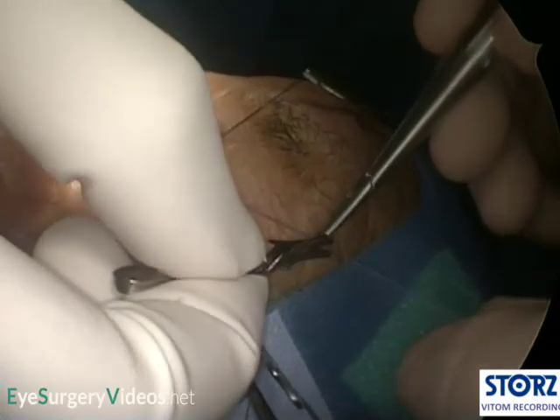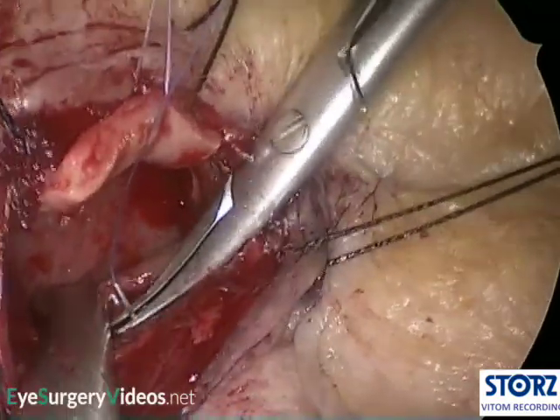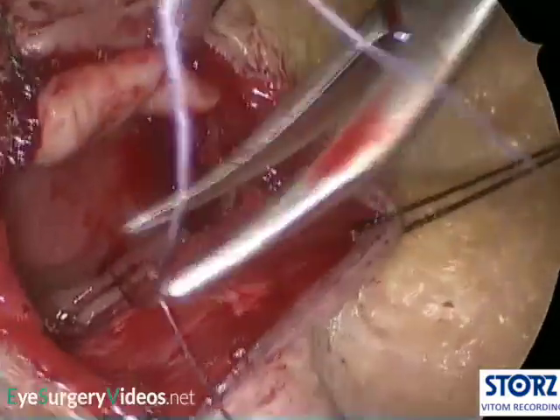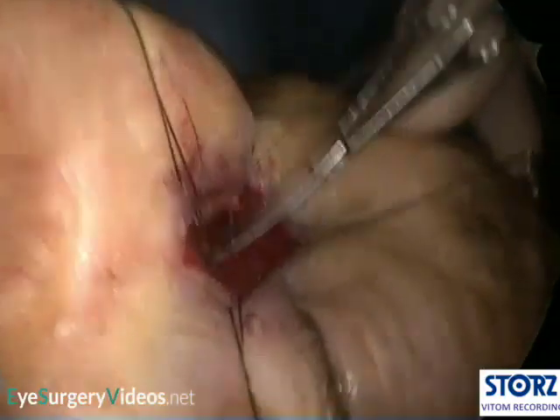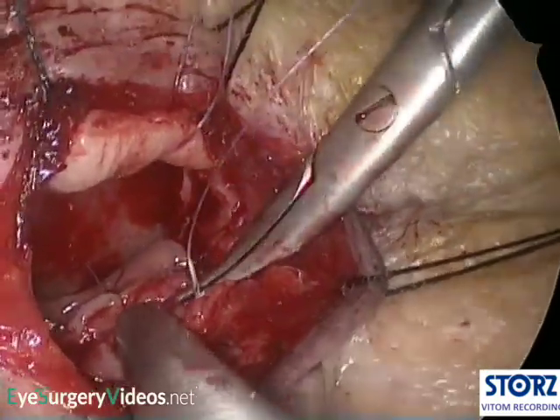A 6-0 Vicryl suture is pre-placed in the anterior lacrimal sac flap. This suture is useful for both retracting the flap during suturing of the posterior flaps and for quickly identifying the lacrimal sac flap later. The posterior flaps are sutured. In this case, 3 sutures are being placed using a Vicryl 6-0. The half-circle needle makes this stage much easier.